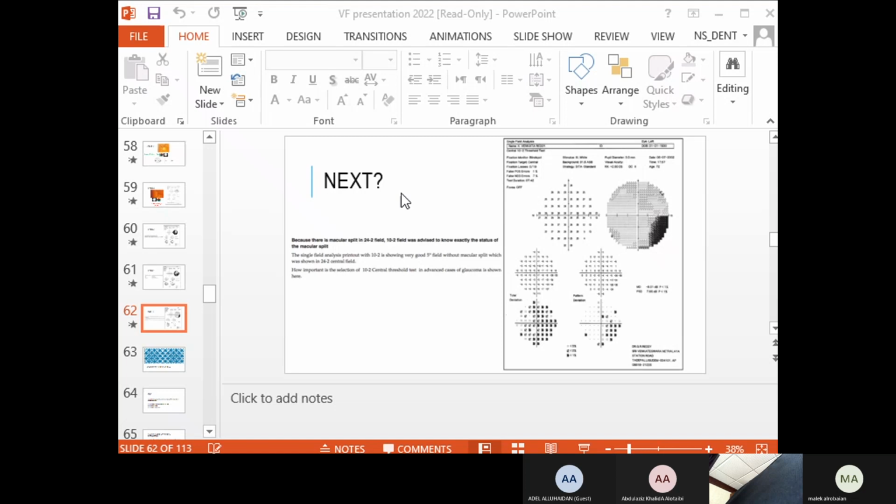Okay. And this one, do you think it is glaucoma damage also? Which one is more severe? Why? Yes, the mean deviation here is more, because the scotomas here are deeper. You see the color is deeper. Although this one is mainly superior and here he has both inferior and superior, this one is more severe, and the cupping here is more. Right. Okay, who's next?